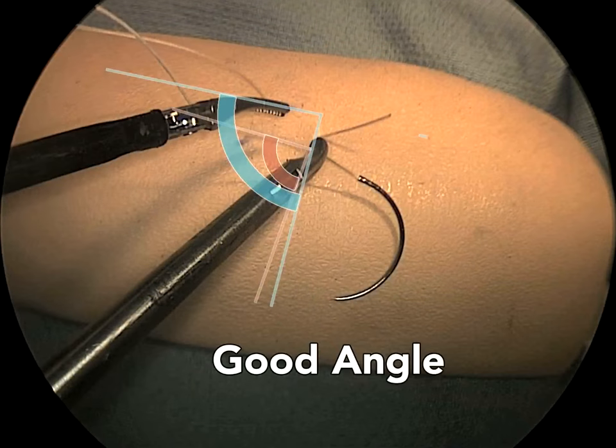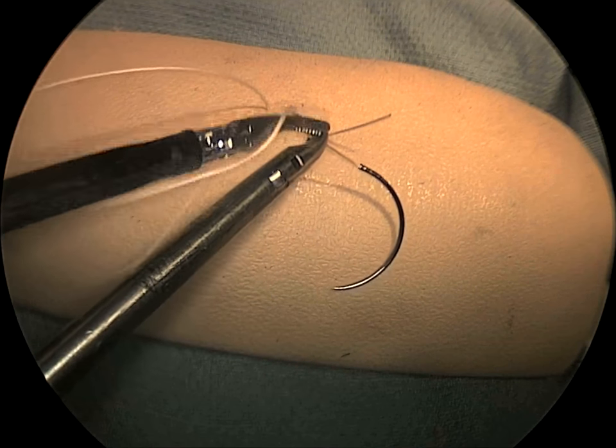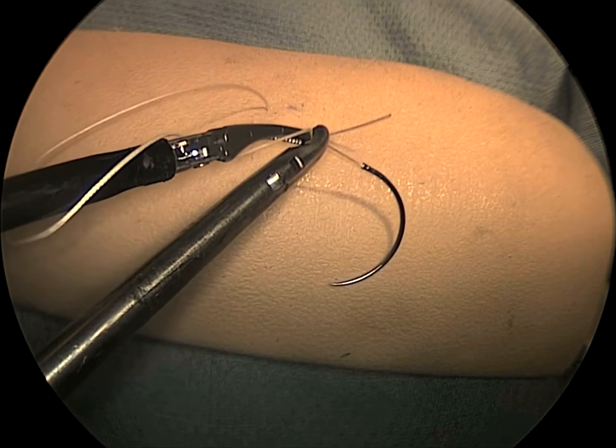Here, both instrument tips are curved toward each other, creating an instrument angle functionally equal to the suture angle — the advantage of curved tips with closed instrument placement evident.